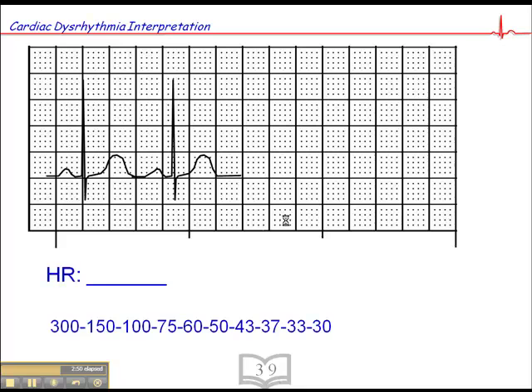Let's try this next one. We find a QRS that falls on a dark line. Counting: 300, 150, 100, 75. So this dark line is 100 and the next is 75. The difference between 100 and 75 is 25, divided by five small squares is 5 beats per small square. So the heart rate is 75, 80, 85, 90.